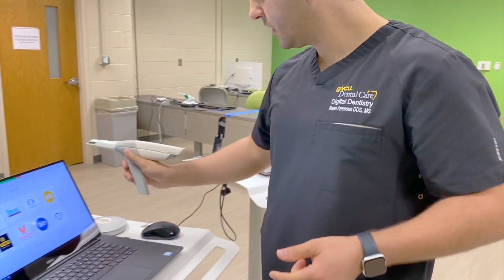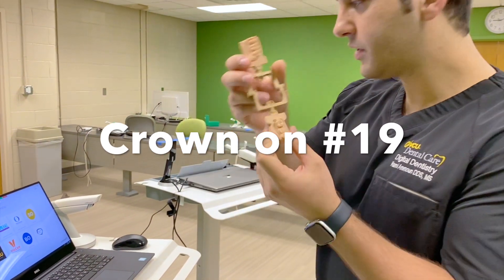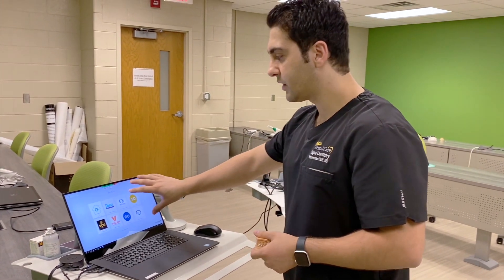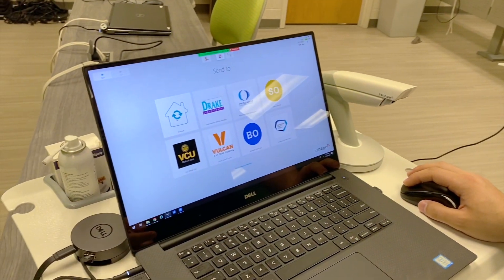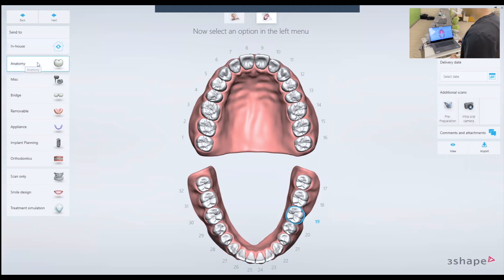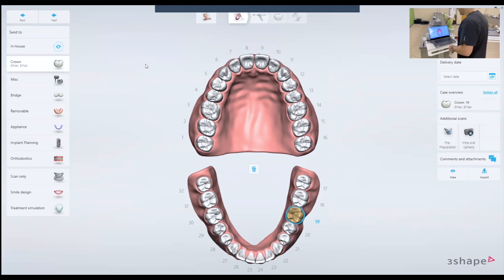So we're going to get started. Here we have our model. We're going to be scanning for a crown on number 19. The computer is already set up and I already created a test patient. When you get to this screen, we're going to select the in-house lab and we're going to select number 19. After this, you select anatomy, crown material is going to be e.max, and the design setting is going to be e.max.